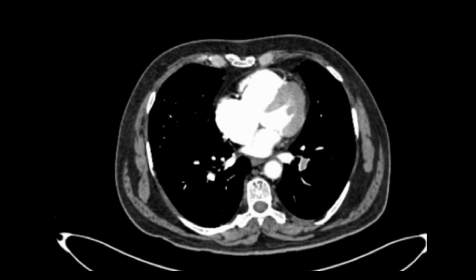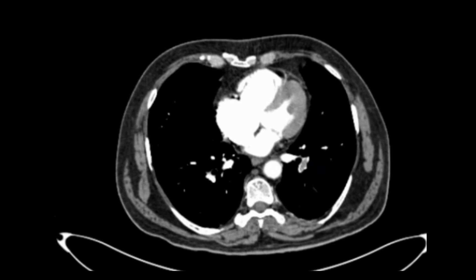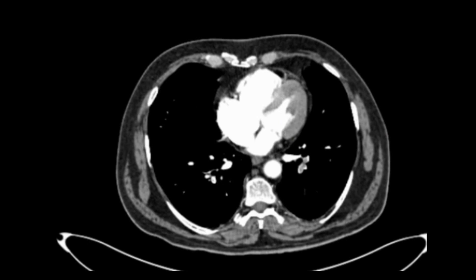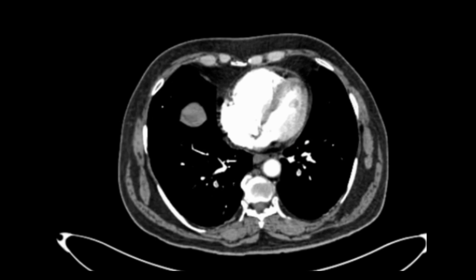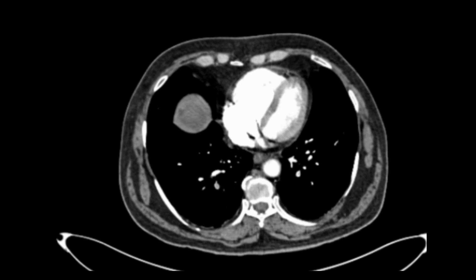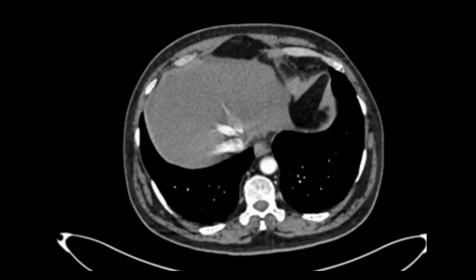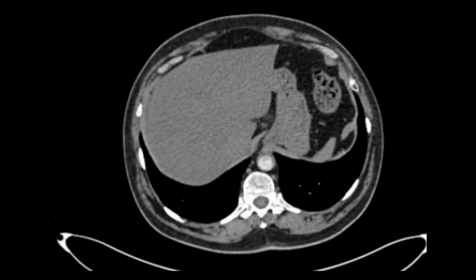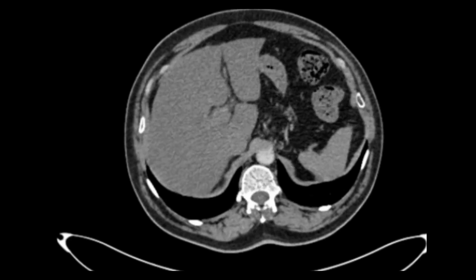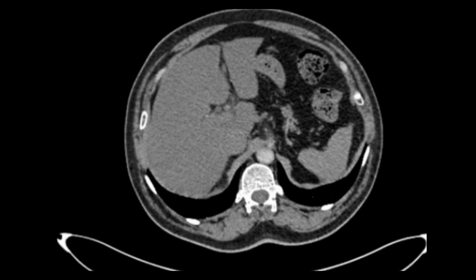As we go down, we can see the four chambers of the heart. The wall of the left ventricle appears hypertrophied. We then follow the pulmonary vessels to the base of the lung; the upper sections of the abdomen are clear.